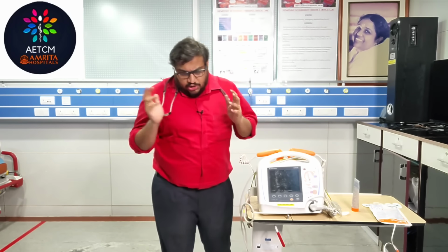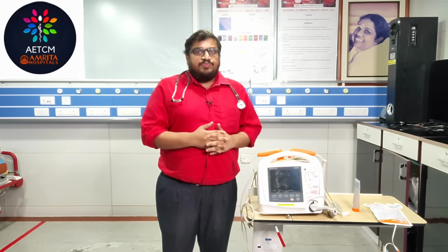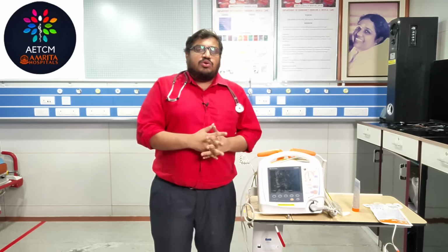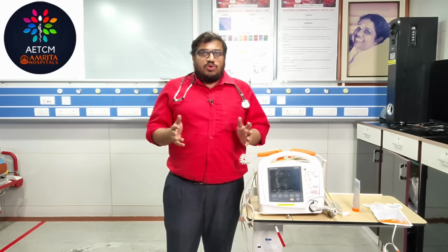And there was a lot of demand for our video, and one popular demand was to show how to use the defibrillator for cardioversion as well as for defibrillation. So before going to the details, the practical aspects, we will quickly look at the difference between a defibrillator, defibrillation and a cardioversion. For that purpose, you should know what the indications are for a defibrillation and what the indications are for a cardioversion.